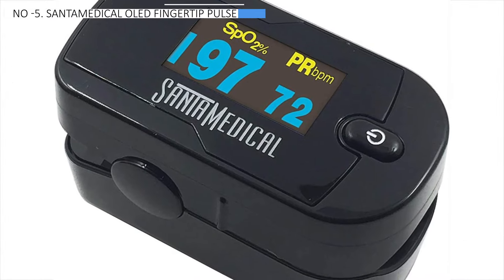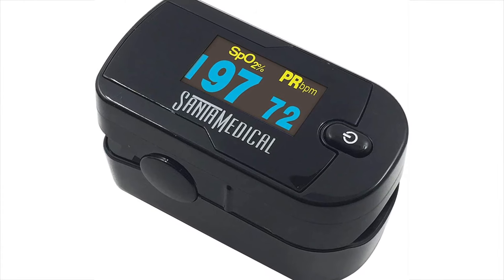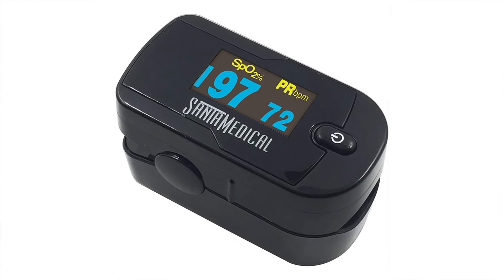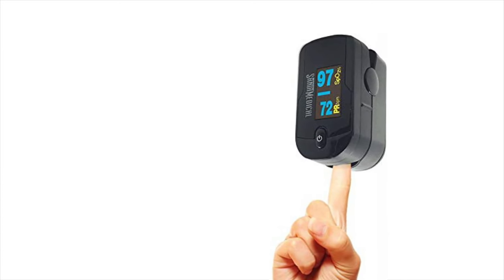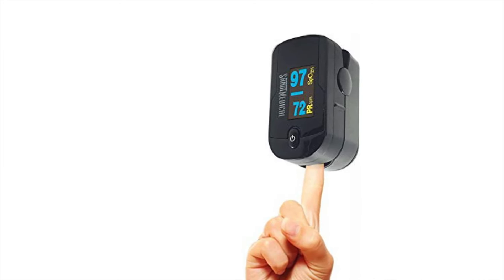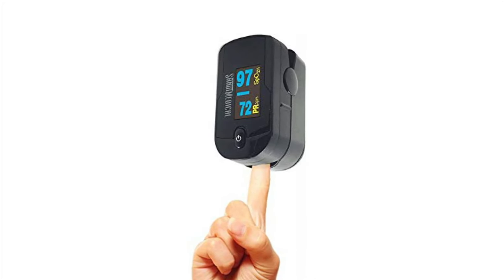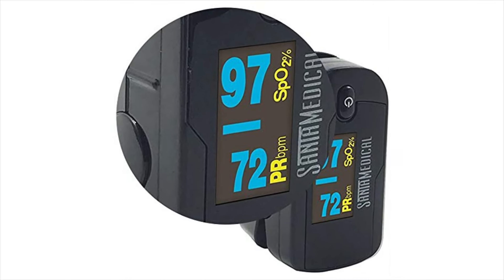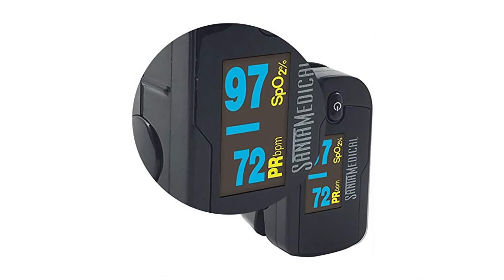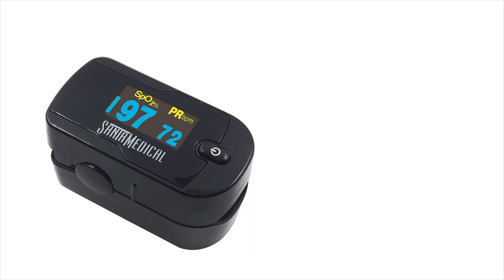At the fifth position, we find the Sante Medical OLED fingertip pulse oximeter, acknowledged as the most cost-effective option. This fingertip pulse oximeter quickly and accurately measures pulse rate and blood oxygen saturation levels. It provides speedy readings displayed on a large digital screen for easy viewing. The oximeter is light, small, and fits a wide range of finger sizes. Its bright display shows real-time pulse rate, pulse rate bar, and oxygen saturation level.